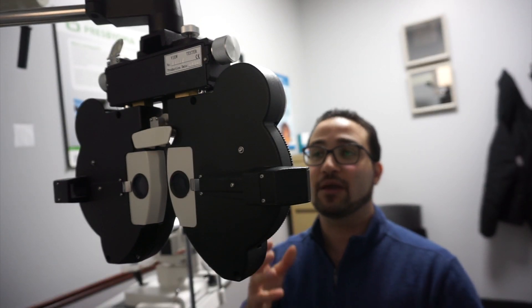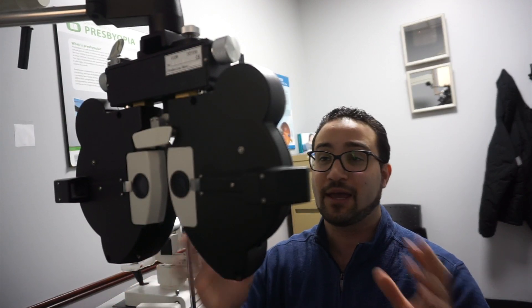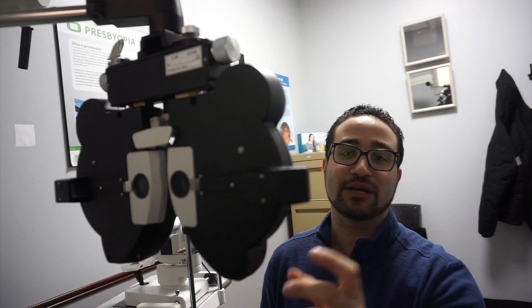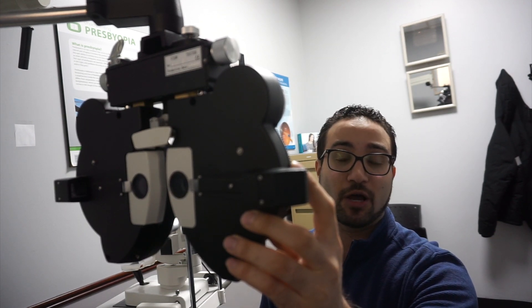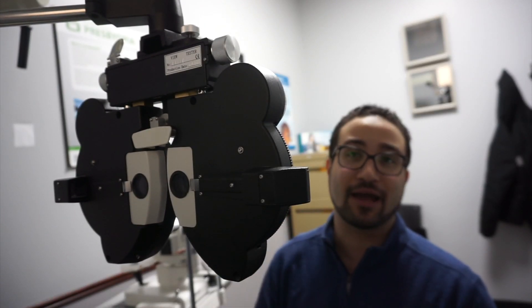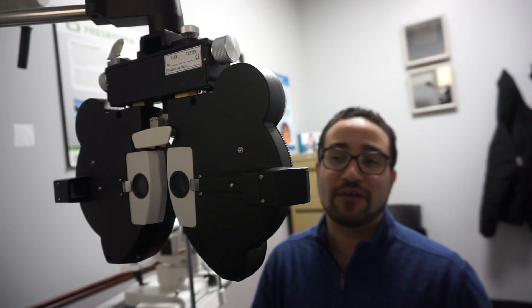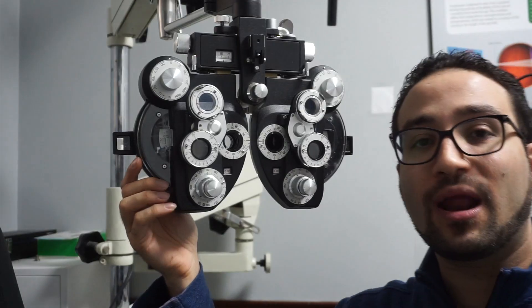Every case is different — you may be doing refraction with both eyes open, you may be blurring the patient; there are many different factors. This is just for a basic understanding. Once the left eye is closed and we're working on the right eye, I put about 0.75 or one diopter of blur in front of the patient's prescription. The patient will have a little blurriness because we've given them about a plus one extra over their prescription. This allows us not to over-minus the prescription.